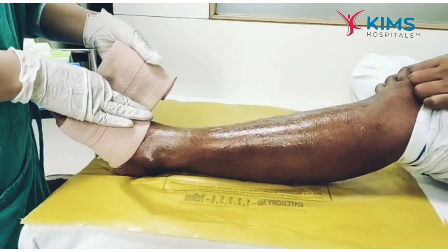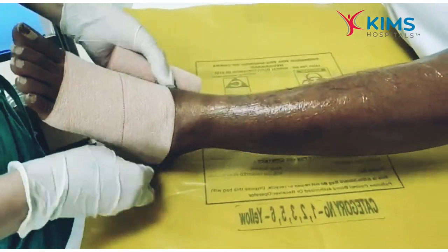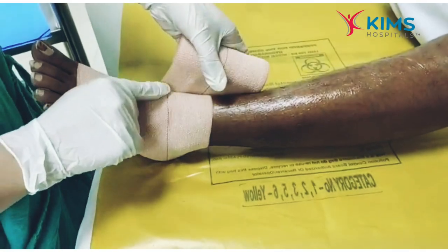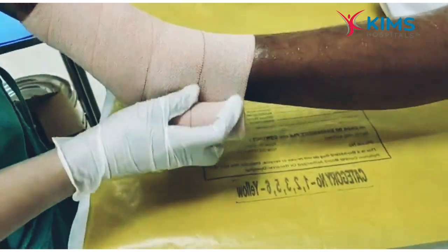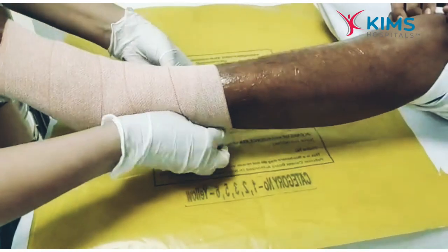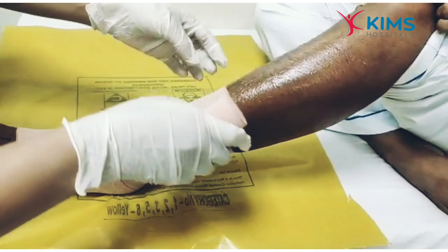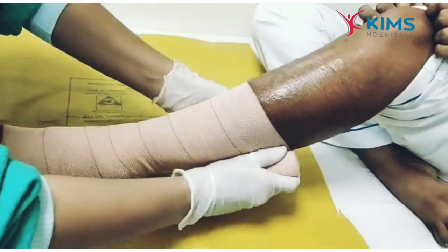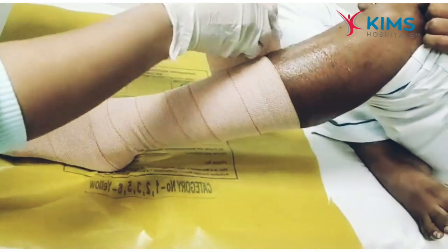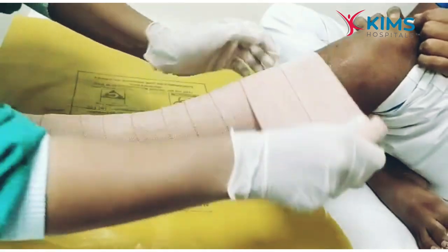Make sure to overlap half of the previous layer of the crepe bandage. You can use the center line as a marking to guide the overlap. Apply the bandage firmly, but not very tight — applying too tight can cause pain in the toes and foot while walking.